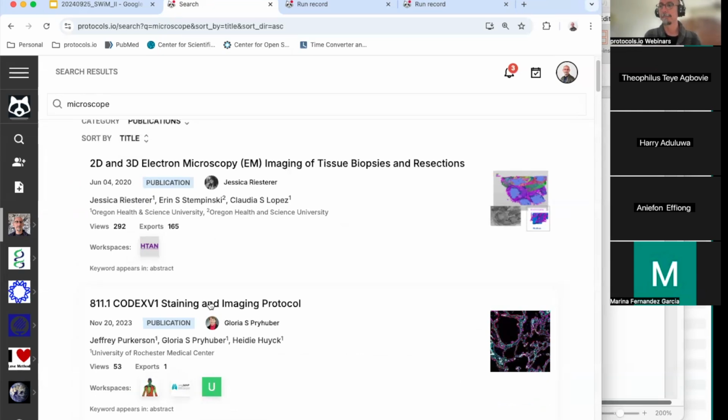Yeah, the reason I'm asking is because the majority of us here are techs and we are working directly with MRI systems. It would be great if we can directly export these protocols in PDF from our systems and import them into protocols.io. It is going to really help us share this with those who are in need of these protocols in different locations.